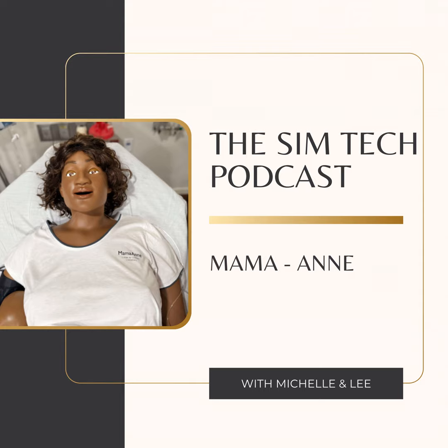I've got to admit, it does make me slightly nervous when people start talking about moving these mannequins, because I generally like to have mine on the bed, it stays on the bed, and I move the beds as much as possible. But when you start saying, look, we're going to put it into a kneeling position, it does, for some reason, make me really nervous, because these are expensive, and if they're ever going to break, it's because people are moving them incorrectly, really.